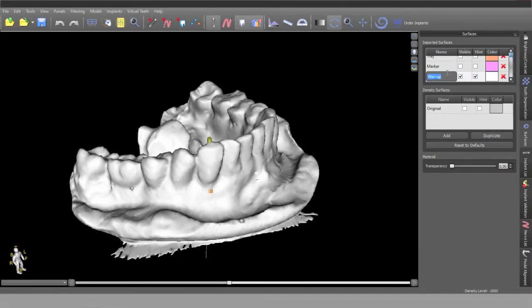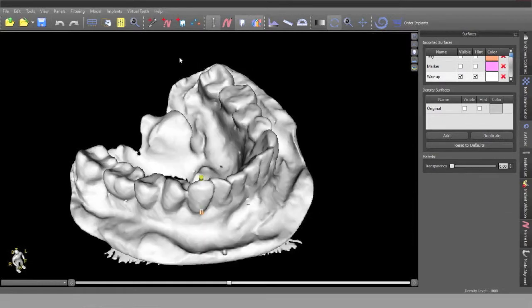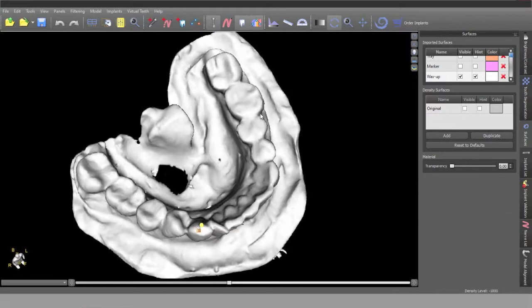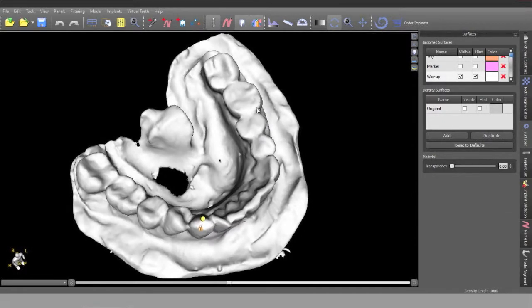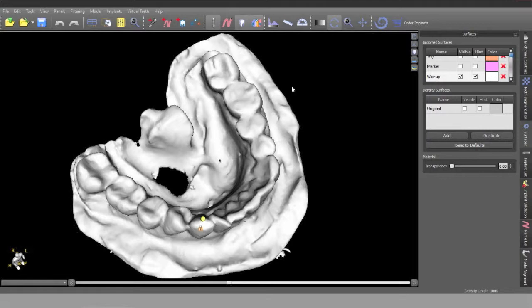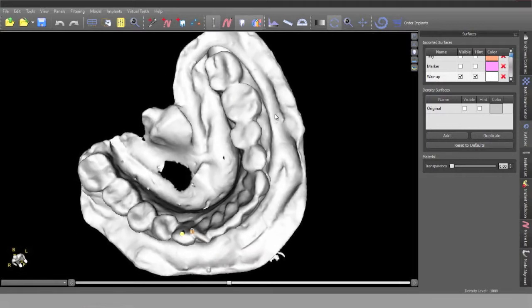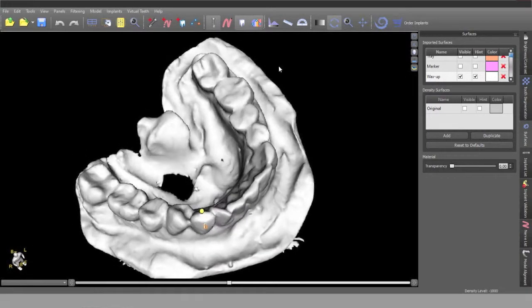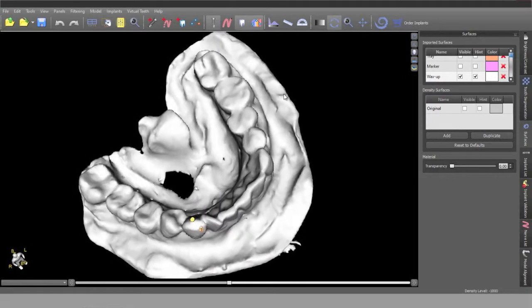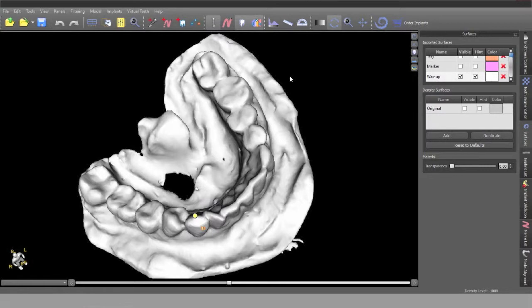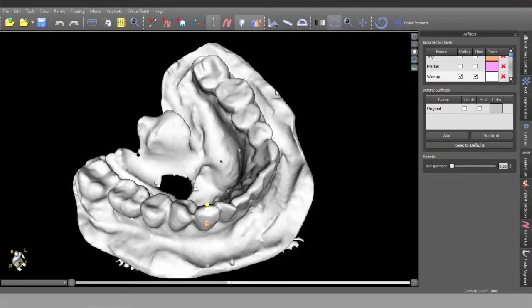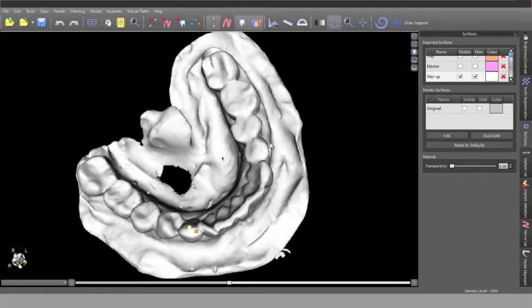So that model was labeled wax-up. But the point of this is that it's just a single tooth, but because the position of the tooth could have been different than the usual, I requested a wax-up. So this is an alginate impression of the wax-up. We poured a stone model and we brought it into the software to show future tooth position.